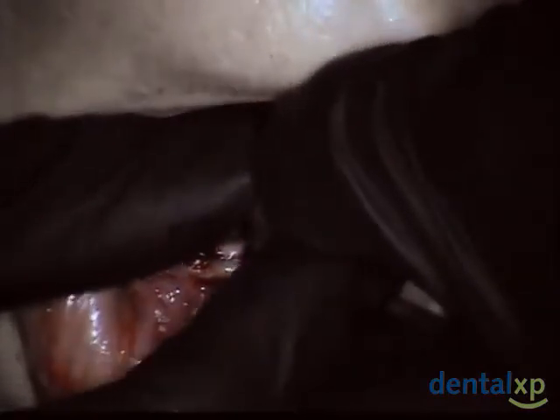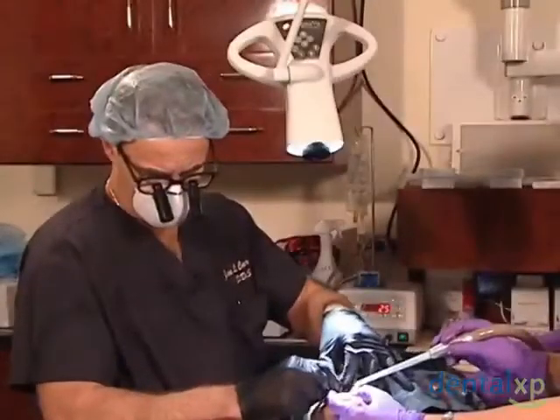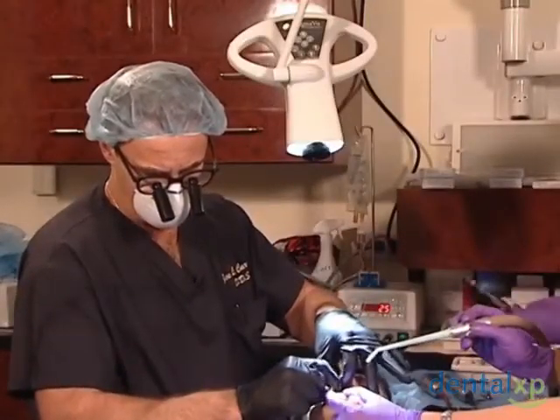As you're placing these, again, position your finger facial to the bone, and if you can, lingual, to make sure that you don't feel any threads. Although you've gone with a scan, it doesn't hurt to double check things because we are very thin in bone in this area. Since we did a punch technique, we minimally reduced the tissue, and that's not a problem as long as you make sure, again, as you're going to place, that you're not trapping the tissue as you seat.